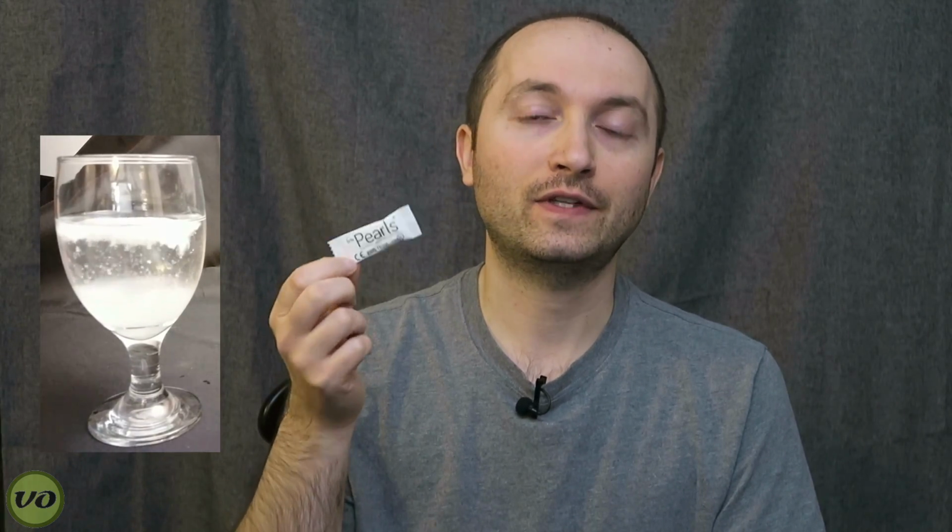Now, another really good use case for this is if you have the flu or you're taking antibiotics or anything else that's going to change the consistency of your output to liquid, these come in really handy. And I know that when I've had the flu in the past, I've used gelling products like this, and it has made my life a lot easier. Now, another situation where you might use this, and I've actually personally used gelling products in the same situations, would be at a hospital. So if you're at a hospital, especially after a procedure where you're not allowed to eat for a prolonged period of time, chances are you're going to have a lot of liquid output in that bag. These come in handy. But if you are in a hospital, I would suggest talking to the nurse that's looking after your care just to make sure that it's okay to use this, because if they're monitoring your output in any way, if they need to check that consistency or they need to check something else to do with your stool, you don't want to start messing around unless they know exactly what you're doing. You don't want to alarm them.